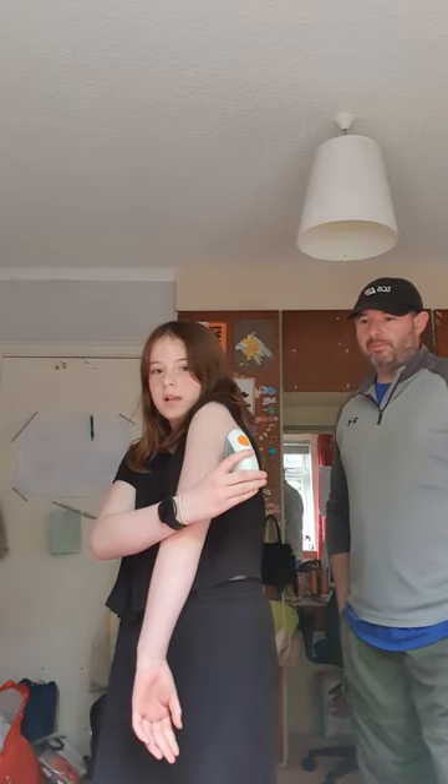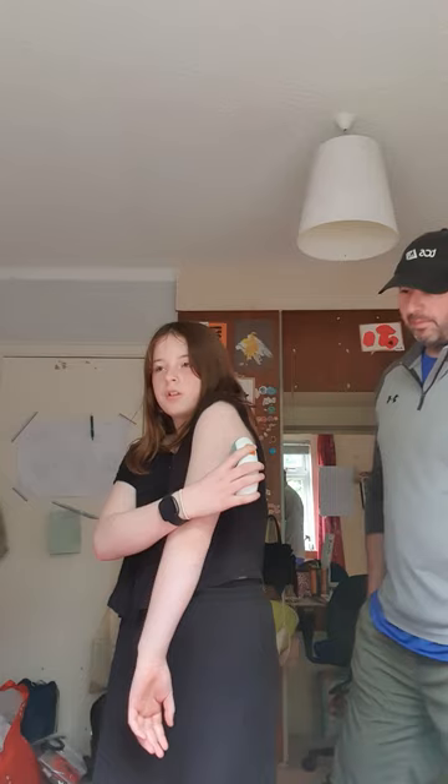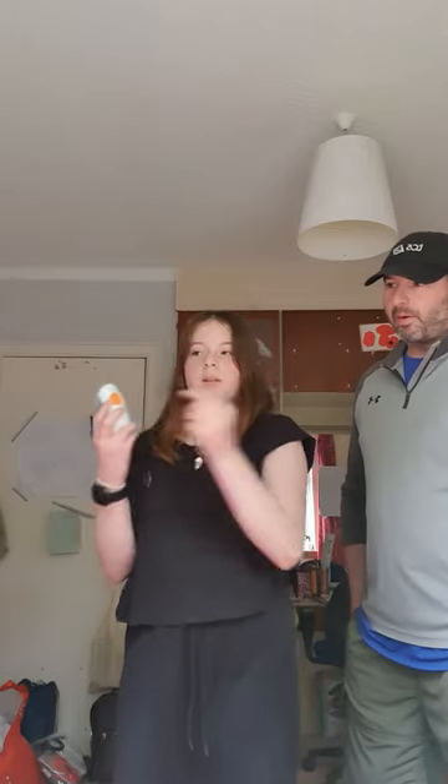Next on your Dexcom you'll remove this big orange thing — do not press that button, whatever you want to do. Remove these two stickers but keep the top one, put that to the side, and make sure it's all pressed down. Now you will go get your adult who doesn't want to do this but you'll get them anyway because you need help.